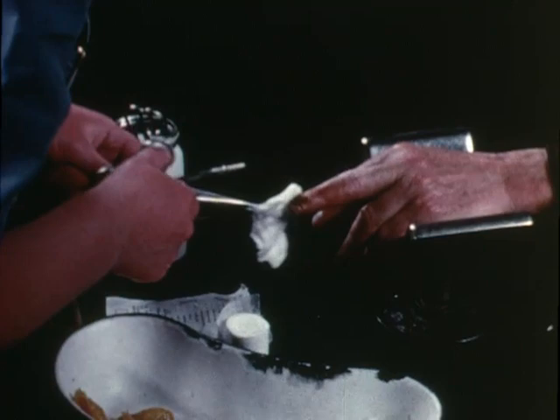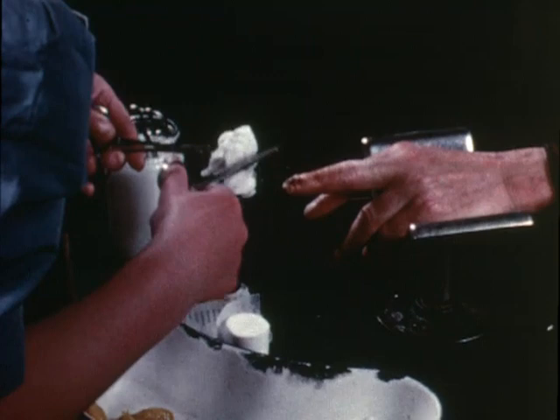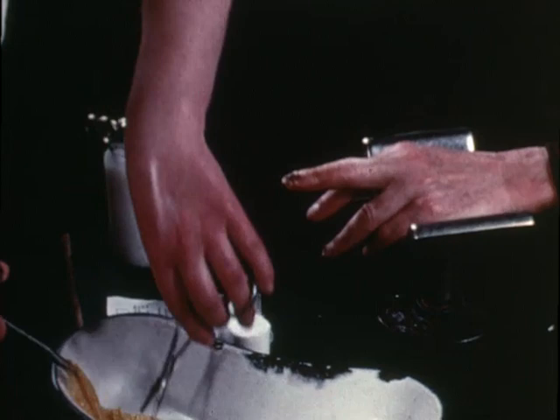So for small wounds, the emphasis is placed on the risk of contact infections, and these can be prevented by a good aseptic dressing technique. The principles of an aseptic dressing technique are the same wherever they are carried out, whether by a team of nurses working together or by one nurse working alone.